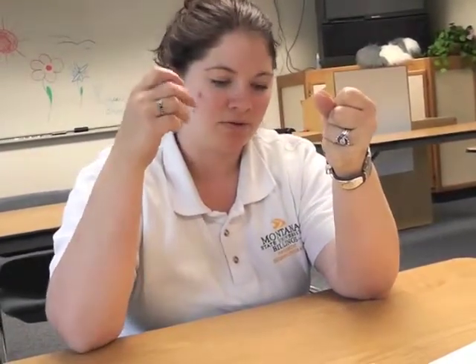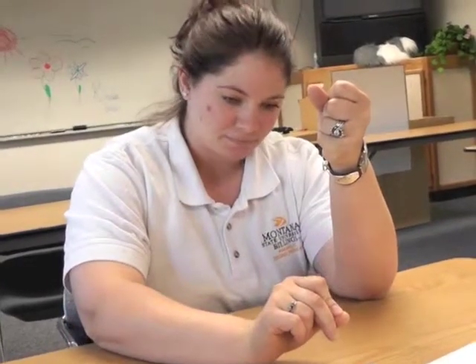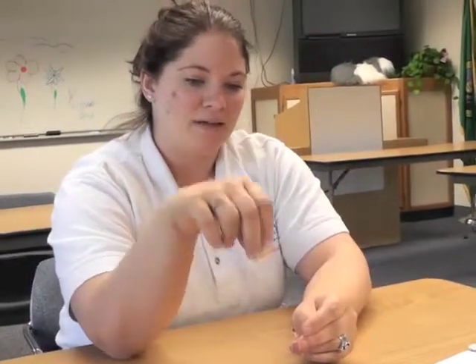Okay, so I'm going to go ahead and pass a 7.0 tube through this patient with direct visualization through the cords. Tube is in. I'm going to take out my laryngoscope and the stylet, and inflate 7 to 10 cc's of air into my cuff. I'm going to put on capnography and also my bag valve mask and have the EMT start breathing for the patient. At this point, I'm going to listen to lung sounds and over the epigastrium. Do I have a good tube? Yep, there's no air in the belly, and you have equal and symmetrical breath sounds on both sides.